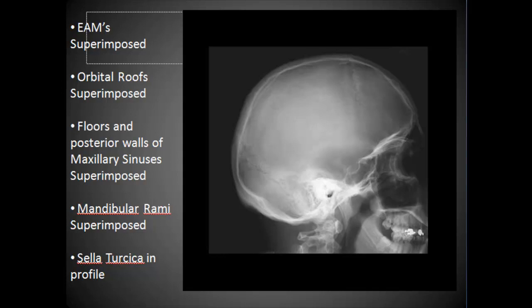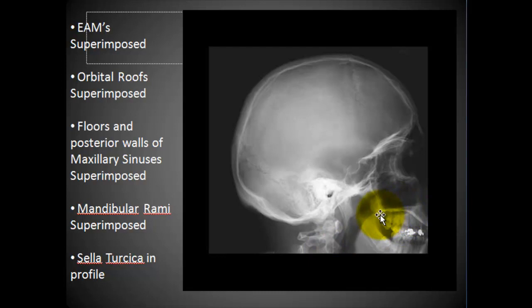For image critique criteria, we want the EAM superimposed. We also want the orbital roofs superimposed, which shows you that you're in a true lateral position. The floors and posterior walls of the maxillary sinuses should be superimposed. The mandibular rami superimposed. You can also look at the TMJs, and the sella turcica should be in profile — a crisp, clean view of the sella.